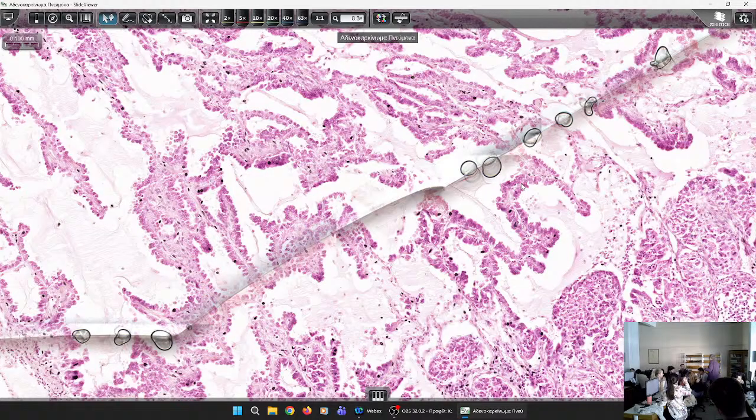However, sometimes it becomes invasive, and it spreads to the stroma. And this is clearly invasion. However, even if it does not invade, it is dangerous because it replaces potentially large portions of the lung parenchyma, so it cannot function properly.